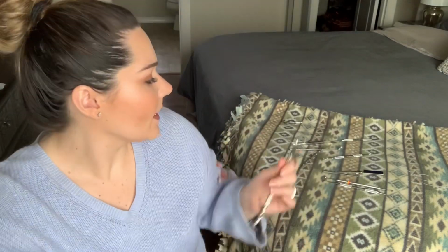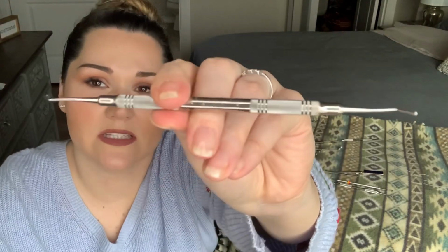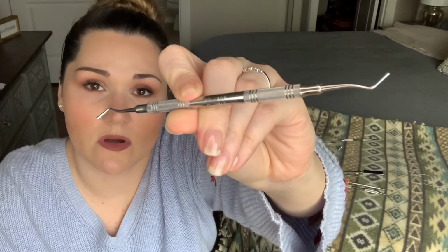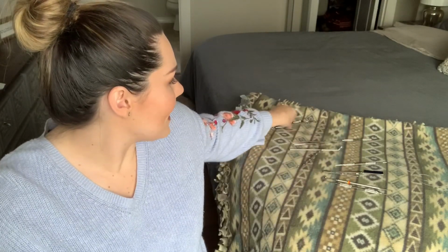So here you will push this into the hole in the tooth or the filling site. And then you're gonna wanna hand him a packer. So this is a packer here, or a condenser, some people call it. This condenses the amalgam or packs it in. So he will use that to push the amalgam into the site. And then you'll go back to handing him more amalgam if he needs it. So let's say he's like, okay, that's enough.